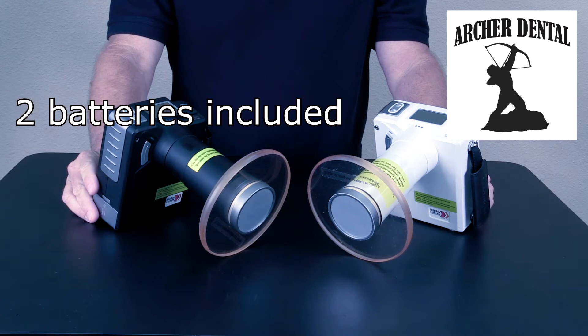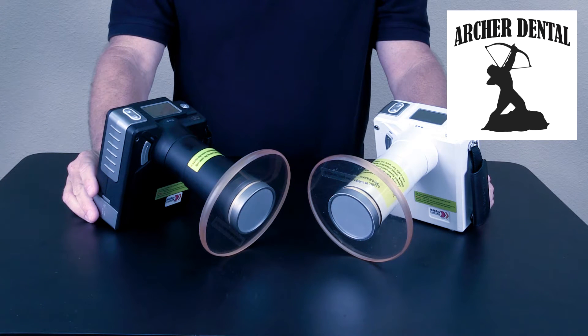It comes with two batteries — lithium-ion long life — with approximately 300 x-rays per charge.